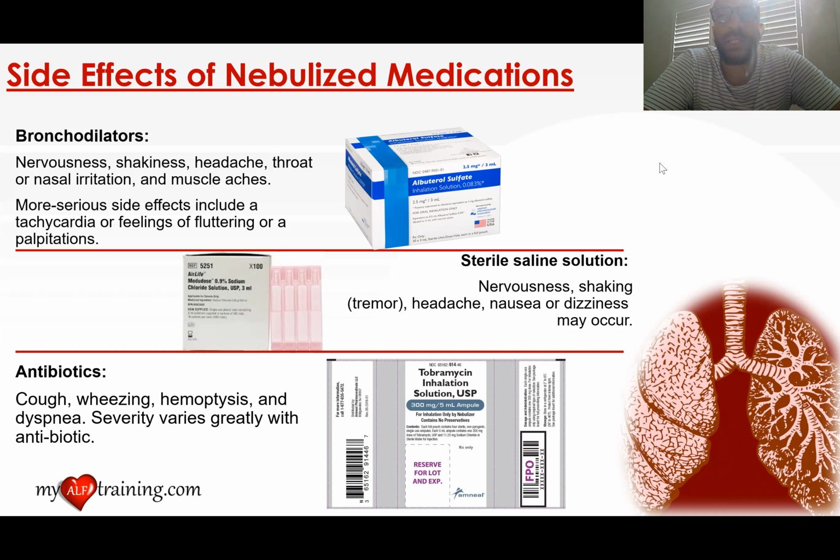You pull the medication, you sit your patient up 30 to 45 degrees, and you let them know that you're about to administer albuterol. But you do your assessment and you see that they have a heart rate of 125. And this is not their normal heart rate. Their normal heart rate is 70.